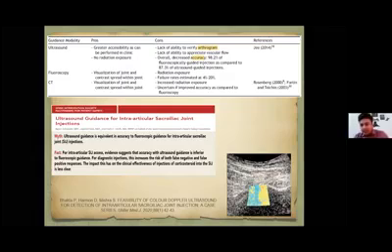But there are some disadvantages also, because we won't be able to inject contrast and see the arthrogram in ultrasound. We can do it via X-ray fluoroscope, but not with ultrasound. And the accuracy in the sacroiliac joint is a little less as compared to fluoroscopy. It is around 87-88%, while with the fluoroscope it is 98 to 99%.